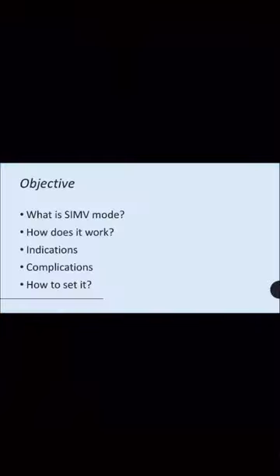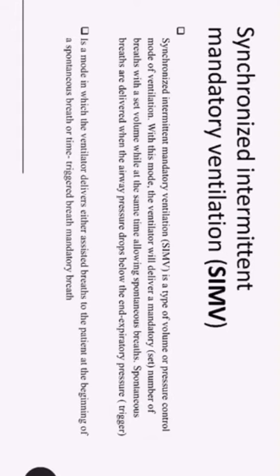We will discover today and represent the synchronized intermittent mandatory ventilation, SIMV mode. The outline is: what is the SIMV mode, how does it work, indication, complication, and how to set it. First, what's the meaning of SIMV mode?